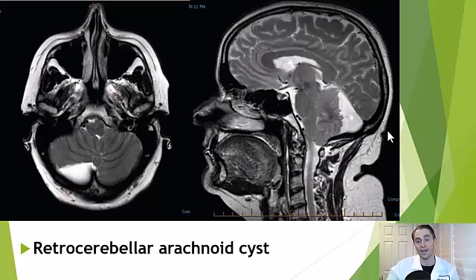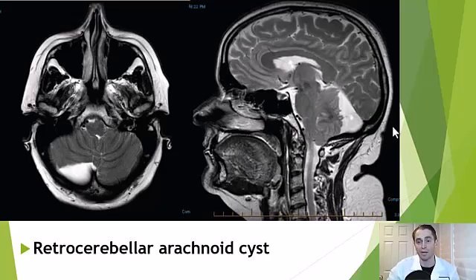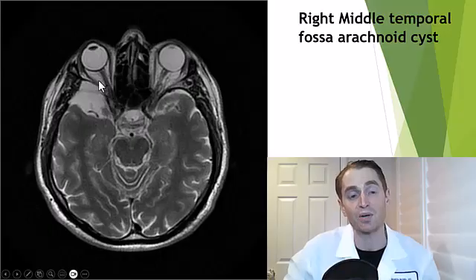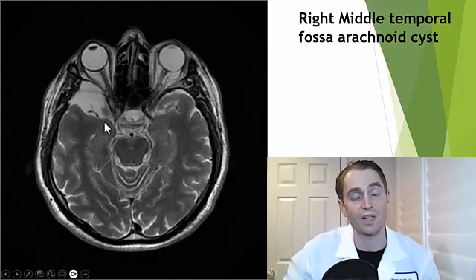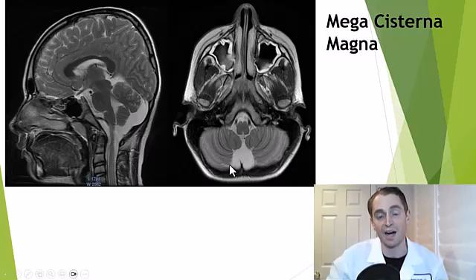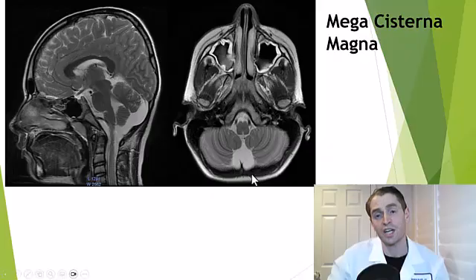On the right, you're looking at a sagittal image, and you can see the same arachnoid cyst posterior to the cerebellum. It's also common to see them in the middle temporal fossa. Here you can see a right middle temporal fossa arachnoid cyst behind the right eye, a very common location. Sometimes you get enlargement of the normal fluid-filled space behind the cerebellum, the cisterna magna, and when it's very enlarged, it's sometimes called a mega cisterna magna.